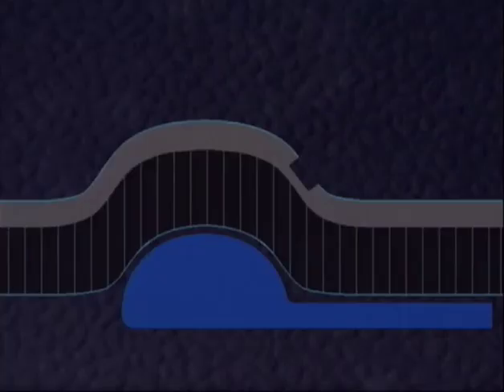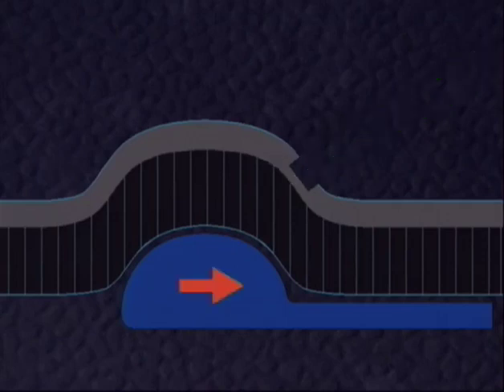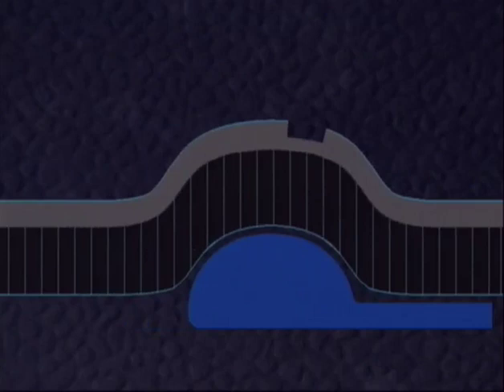How can we take advantage of these phenomena for analyzing properties of the retina? For example, a partial thickness hole at the anterior face of the protuberance will hardly be visible because, for those rays meeting the lesion, the difference between full and partial thickness is small. However, if the indenter is shifted until the lesion is at the summit, the difference in thickness becomes large for traversing rays.